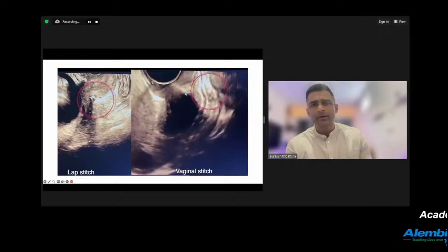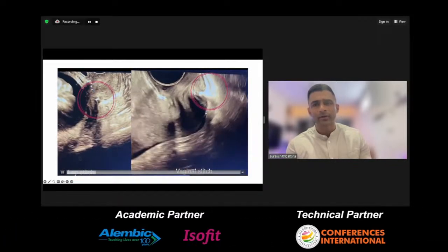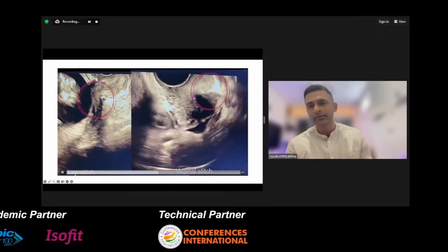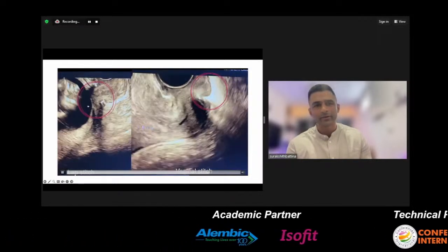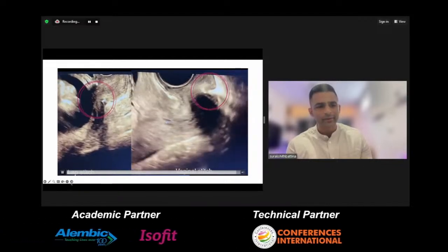Again, when you compare it to a laparoscopic and a vaginal stitch, I think there's absolutely no comparison. Many people say it's the same, but I don't think so. There is a chance of failure for a vaginal cervical stitch, but when you look at a laparoscopic stitch, it's a way up, and the chance of failure is very, very less.